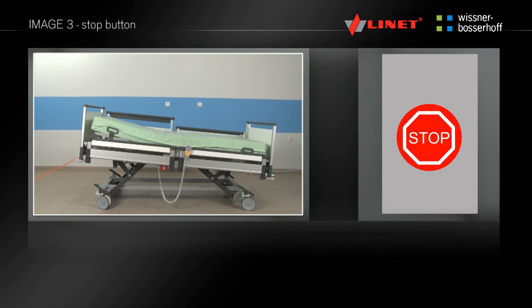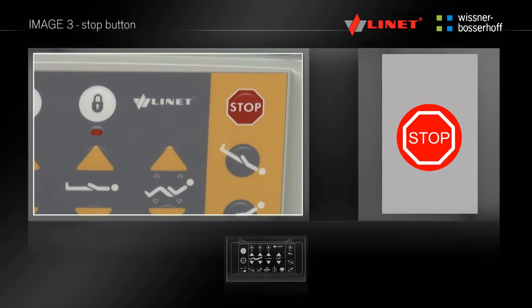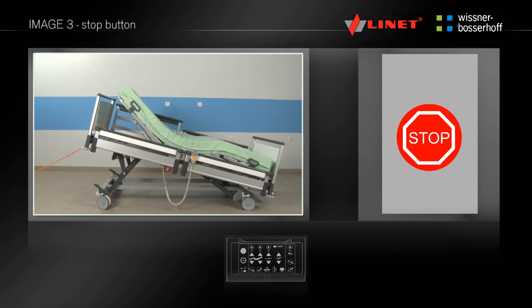In situations where you need to immediately stop undesirable positioning of the bed — for example if the patient is moving the bed to an undesirable position — press the stop button located on the nurse control. This feature allows you to stop any bed movement.